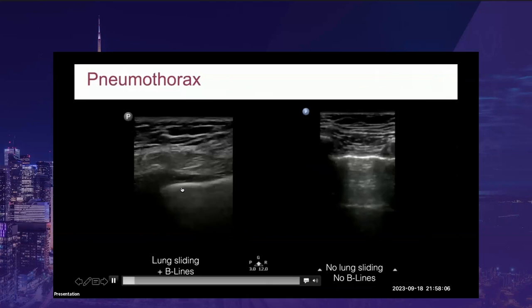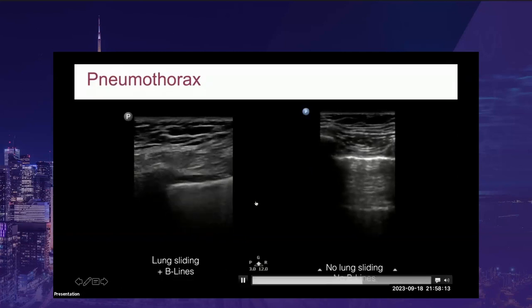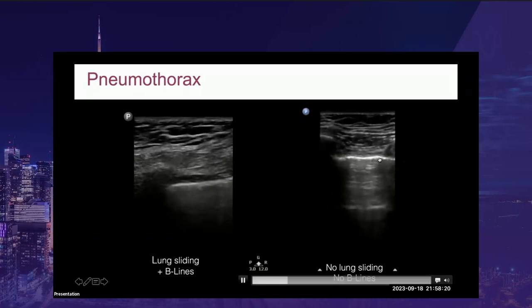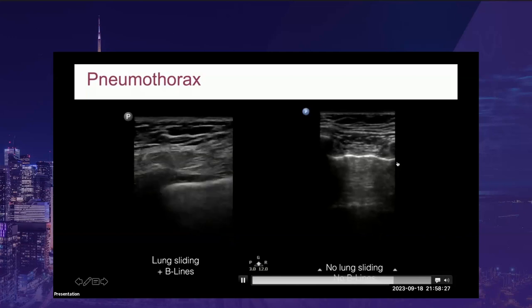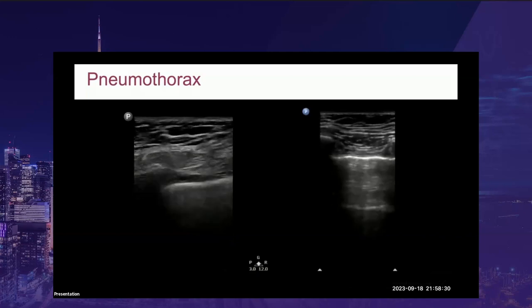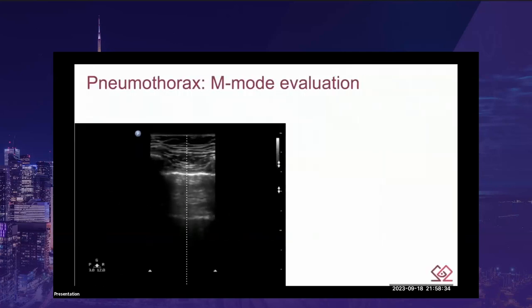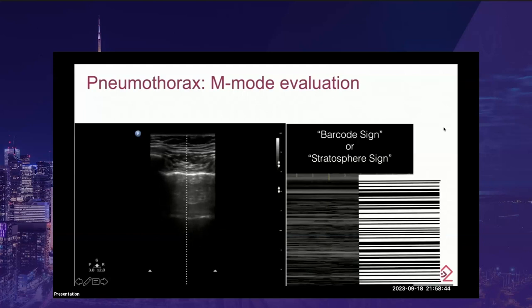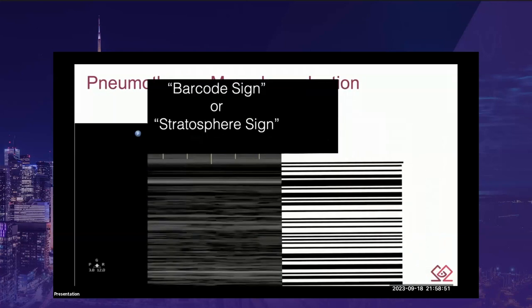In contrast, this patient has no lung sliding and no B-lines visible. If you put M-mode over this image, you would see the same static appearance below the pleural line as you see in the chest wall — what we call a barcode sign or stratosphere sign. This is significant for a lack of lung sliding and something you should confirm anytime you're worried about absent lung sliding.